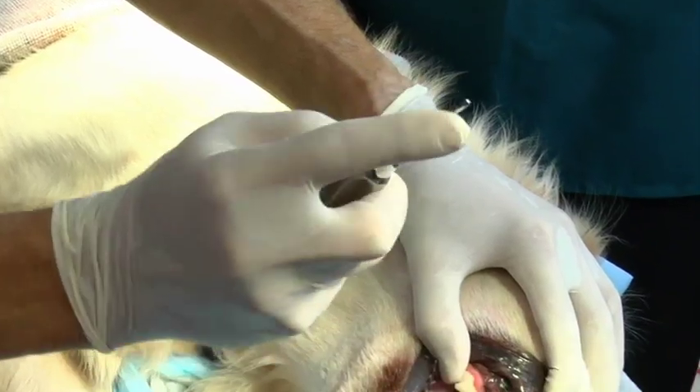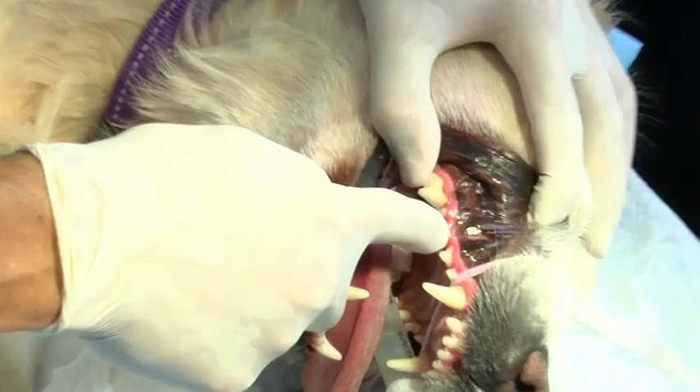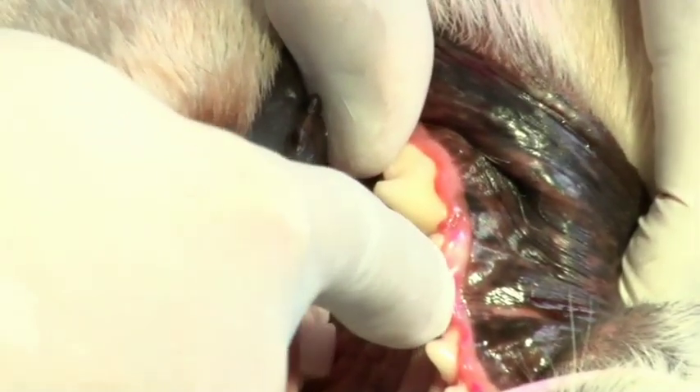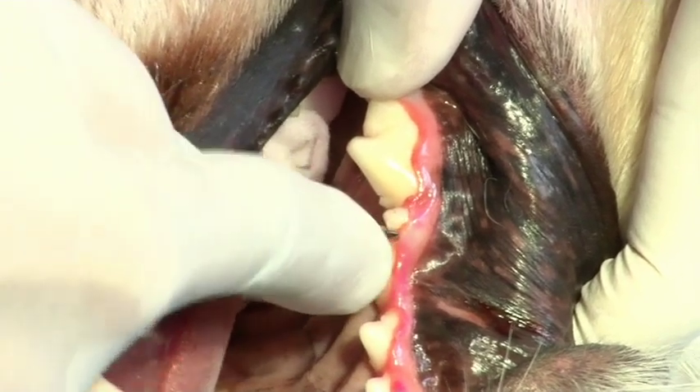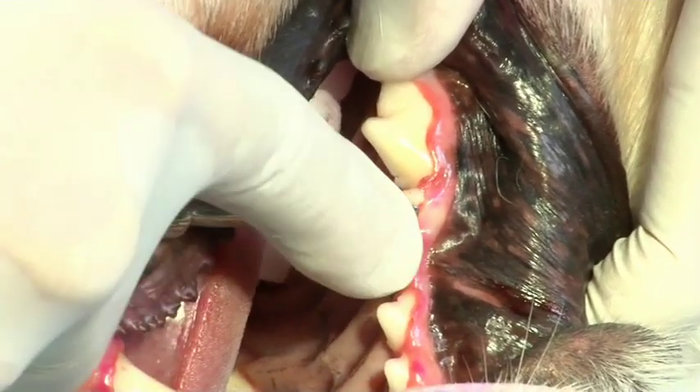To extract the tooth, the dental elevator is applied to the mesial side of the tooth and, in a rocking action, moved along the root. This will stretch and tear the periodontal ligament fibers.